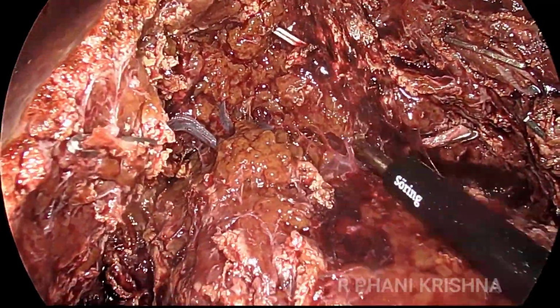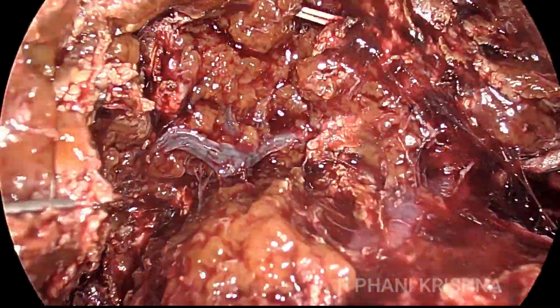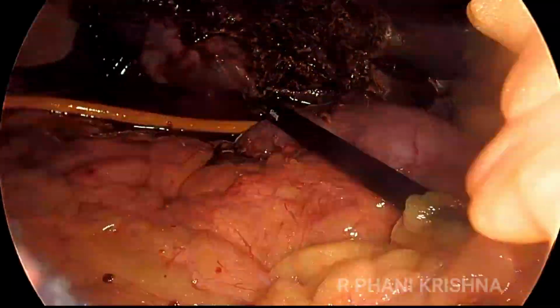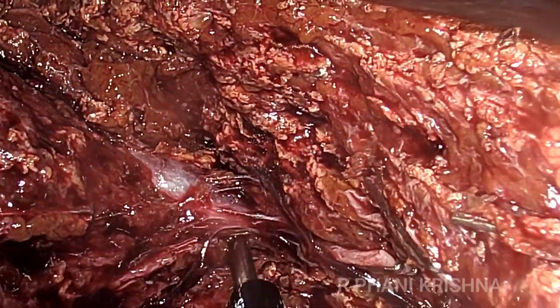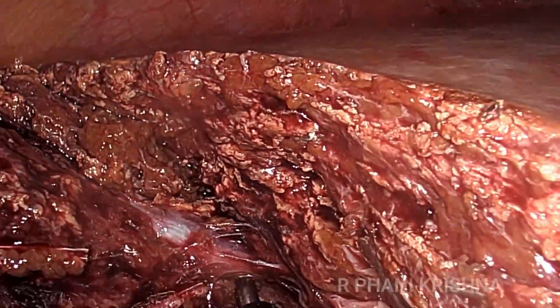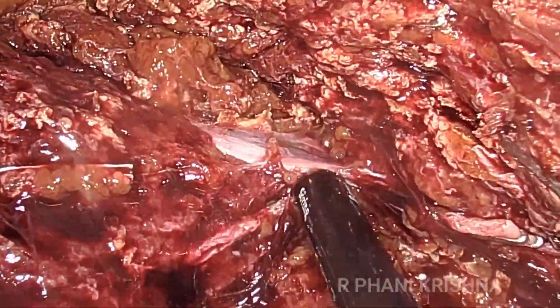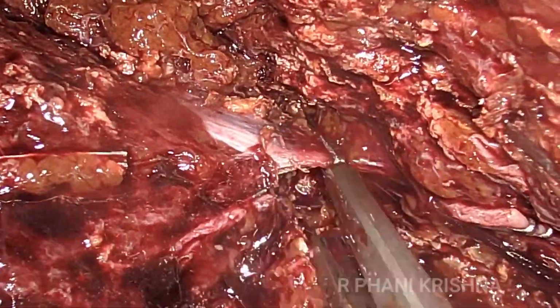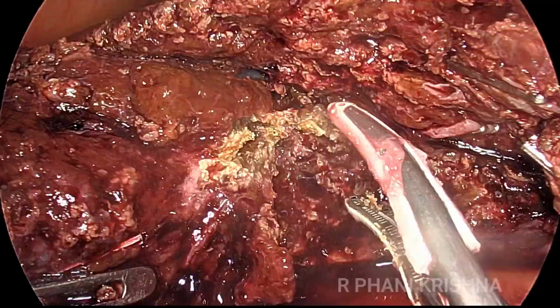So the wedge, even if it's 4B5 or a 2 centimeter wedge or a 3 centimeter wedge, as you approach towards the hilum, end your transection line a couple of centimeters above the hilum, and also stay away from the hilar structures.